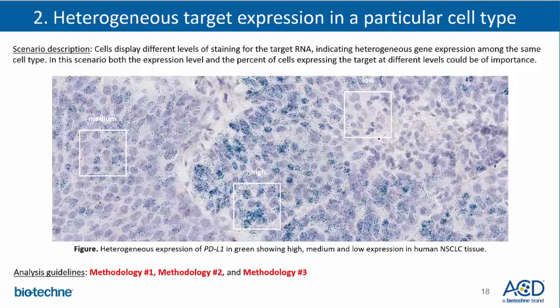In this non-small cell lung cancer example, the tumor cells in different areas of the section are expressing PD-L1 to a different extent, with medium PD-L1 expression at the left, high PD-L1 expression in the middle, and low to no PD-L1 expression to the right.